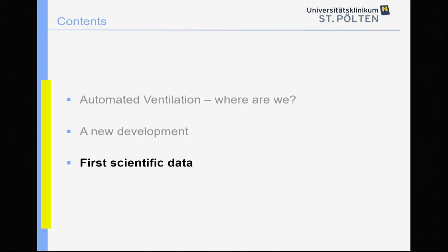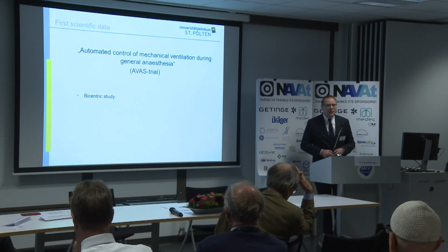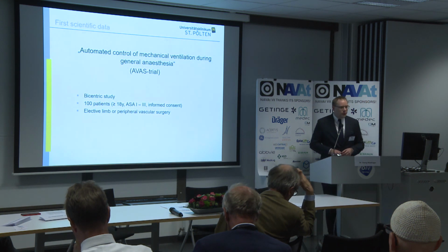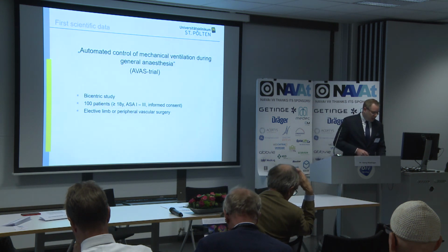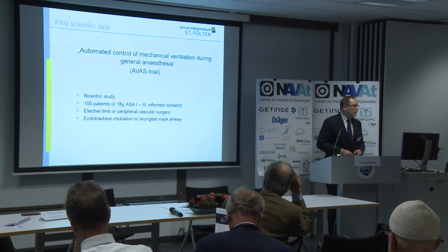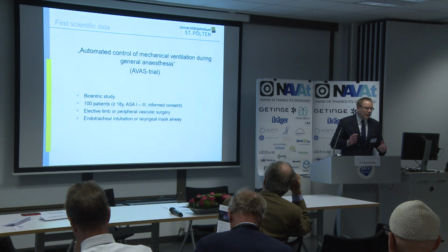Okay, now let's go ahead. As I mentioned, you'll be the first ones to hear our first gathered scientific data concerning smart ventilation control. We did a trial called the AVAS trial. It was a bicentric study together with the University Hospital in Kiel in Germany. We included 100 patients who underwent elective limb or peripheral vascular surgery. And the airway was managed either by endotracheal intubation or by laryngeal mask airway, depending on the clinical situation.